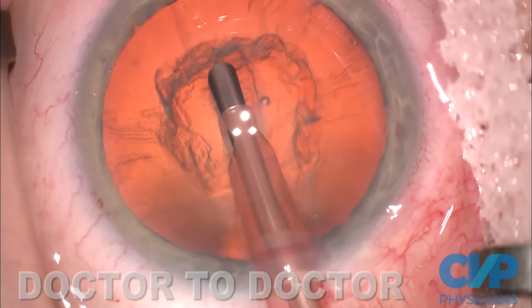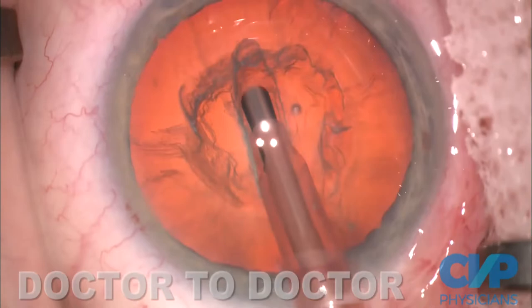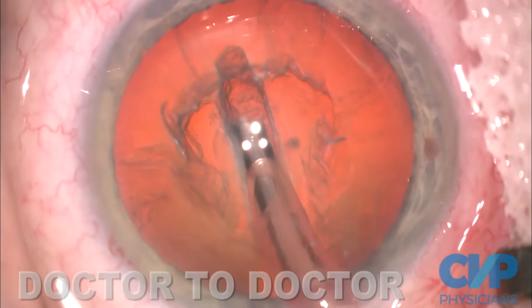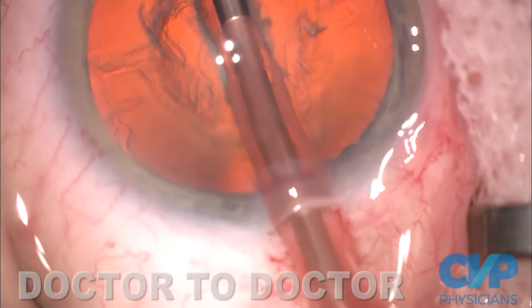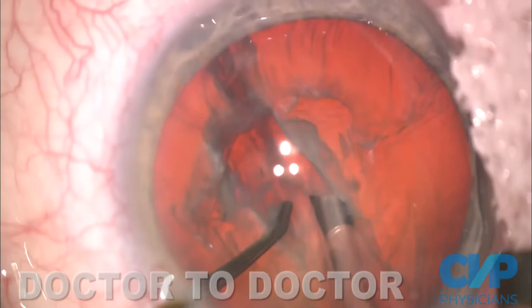When I get about halfway through the nucleus, I make a couple of changes. All the energy has gone backwards, so now I'm deep and it doesn't matter — I can turn the tip around. When you sculpt, you don't occlude, so I bring the vacuum way down so I'll never go through the nucleus accidentally. This also leaves the OVD in the anterior chamber, so the Helon 5 is there the whole time and the cornea really doesn't know I'm working. I sculpt deeper. I'd like to point out the anatomy of the lens — the Y sutures — so I know where I am. Then I use a divide technique and crack the lens into two hemispheres.